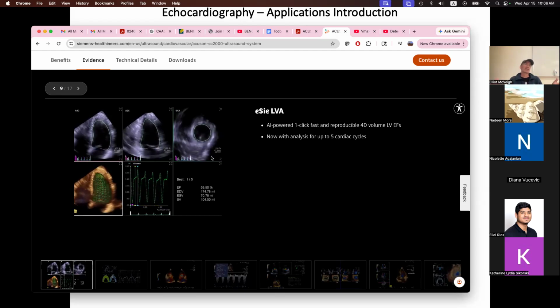And so it has to sacrifice something, and it's sacrificing spatial resolution because it's not sampling clearly. However, if what you want to see is real-time ventricular function, it's pretty good, right? So you get this volume and it shows you what is happening to the volume in real time.